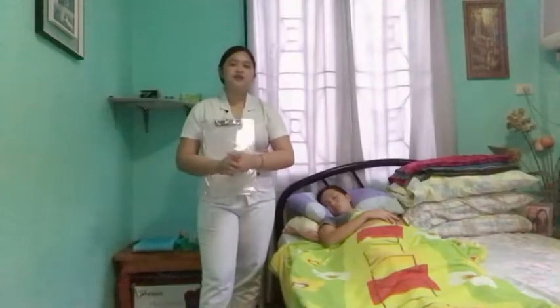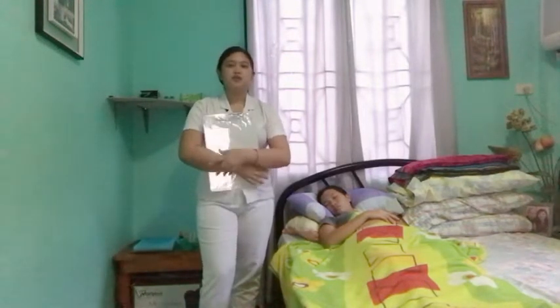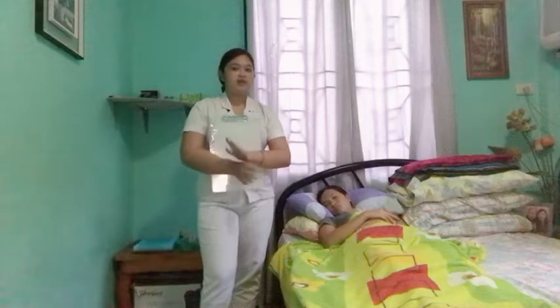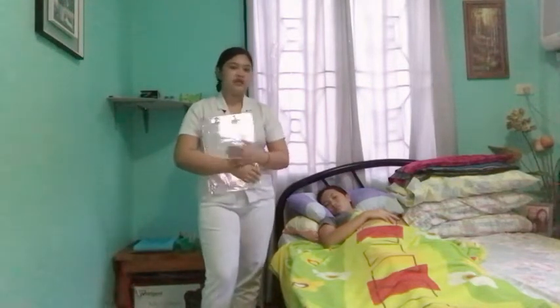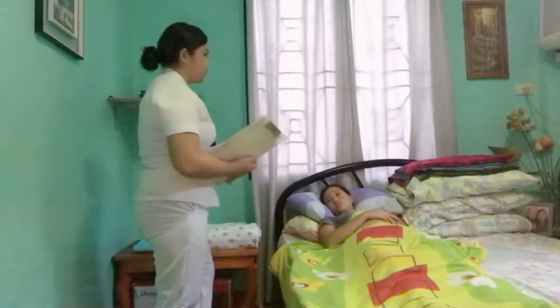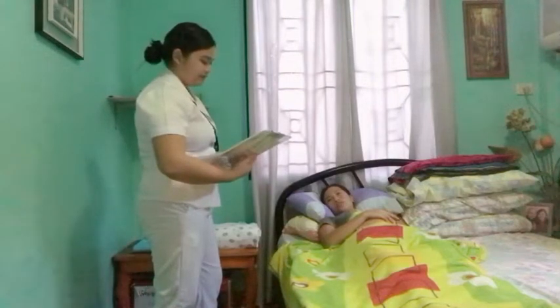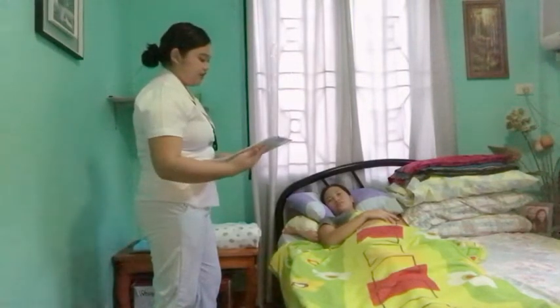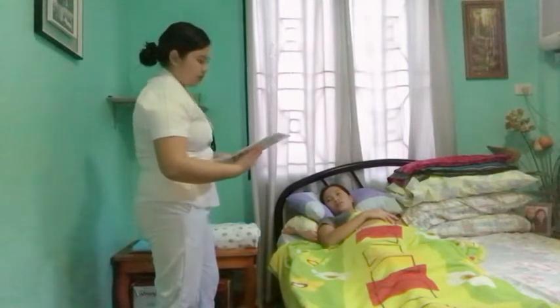Then, identifying the patient and explaining the procedure is very vital, for this will let the patient feel reassured of the procedure, and if it is explained, that she is handled properly and considerately. So, good morning ma'am, I am Sandra May Ibranyola, your student nurse for today. Can you please state your complete name? This is Dayan G. Erola. Okay, your birthday and civil status please. January 6, 2004, single. Okay, thank you very much ma'am.